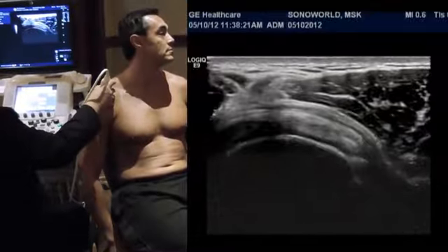The fourth of the 4-quadrant exploration of the shoulder is going to be the posterior shoulder, where we're going to look for the glenohumeral joint, look at the ball and socket maneuver of the area, and also we're going to try to show if there is going to be an internal impingement during those motions. We'll begin by putting the probe transversely across the model's back and adjust the depth since it's a deeper structure.